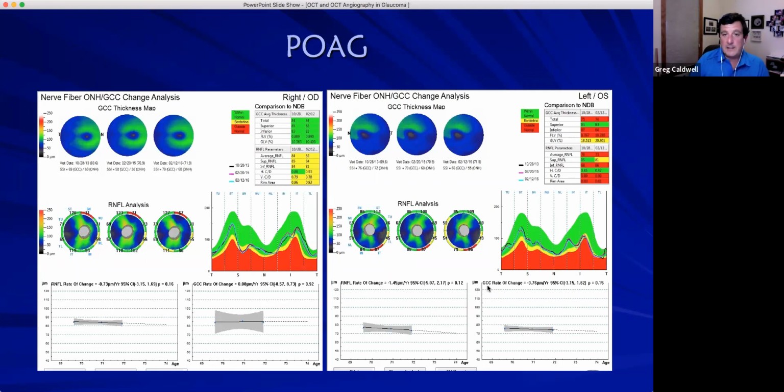And that's really because when they do this measurement, and you can, if you're doing them yourself, or if you have a technician, when they do the ganglion cell complex, they say to the patient, just look straight ahead. You should see a green or red dot. Just look straight ahead, because that's the macula. But in order to get to the optic nerve, they got to eccentrically fixate. Hey, look over there to the side.